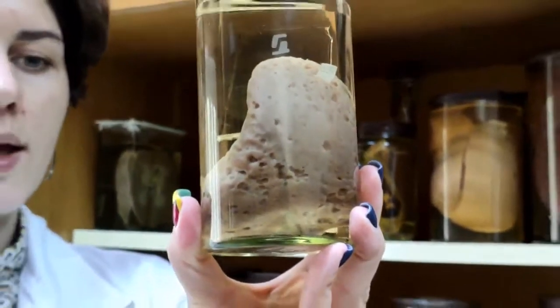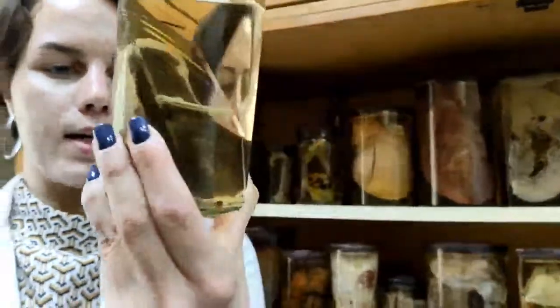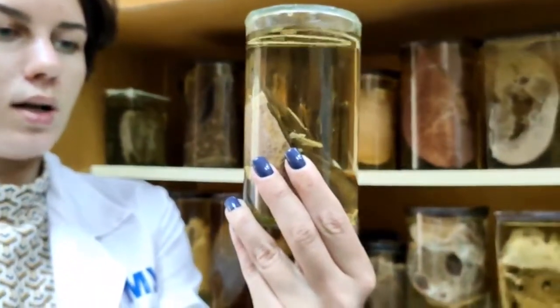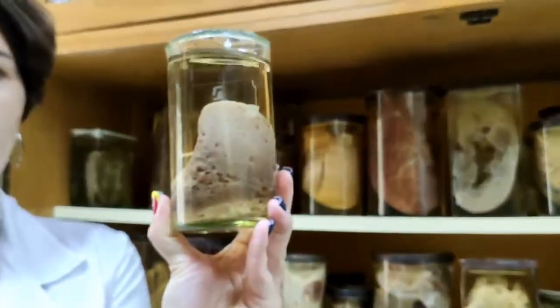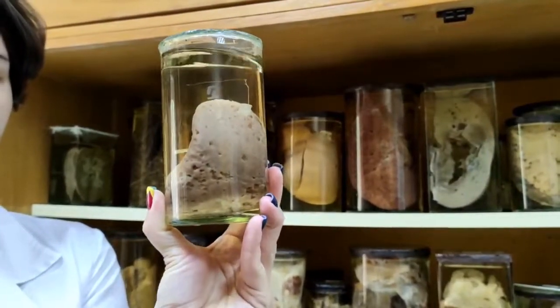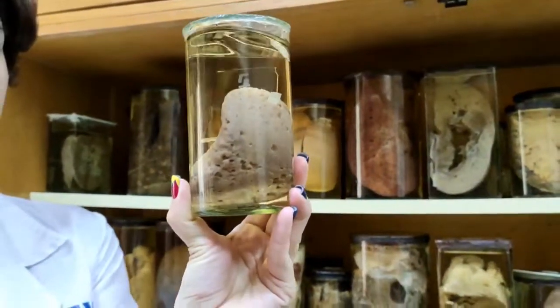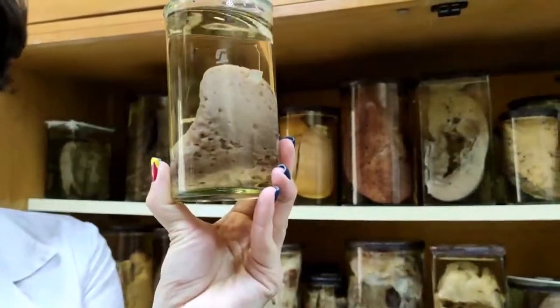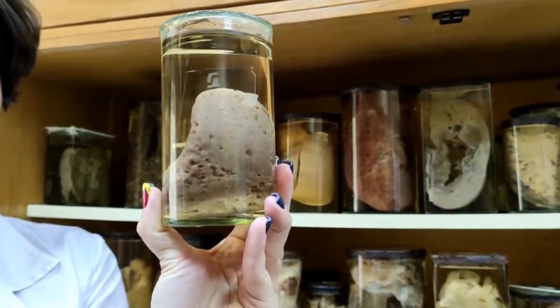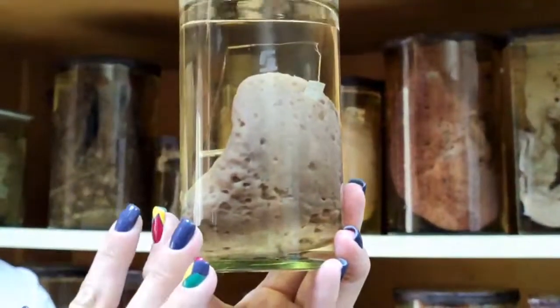Spleen. Here you can see that the capsule of the spleen has white color, but if you look at the parenchyma, it's of usual dark brown color. We can see this condition when, for example, near this spleen in the abdominal cavity there are some inflammatory diseases, and that is why the capsule changes and we can see hyalinosis. That is why it's quite dense, firm and white. Normally it's transparent, not like this. Hyalinosis of the spleen.